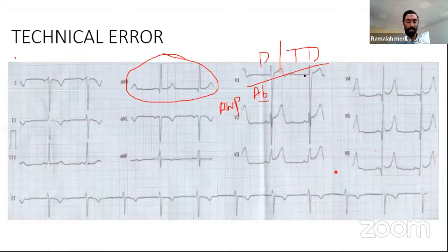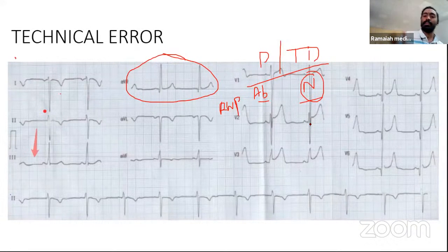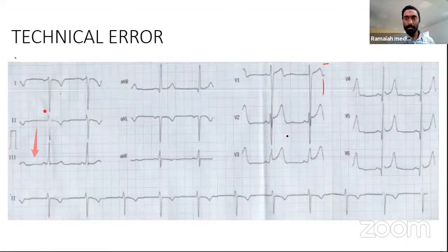And in technical dextrocardia, it is just a limb swap, but the precordial leads are normal. So it will be normal. This is how you distinguish. This is clear, no? Yeah, in dextrocardia, it will regress from V1 to V6. Very good. We will get a reverse R-wave progression. Correct. So this is about dextrocardia, and this is technical dextrocardia.